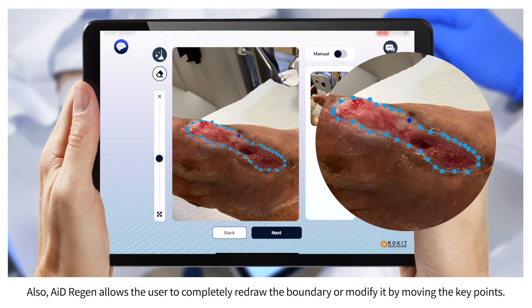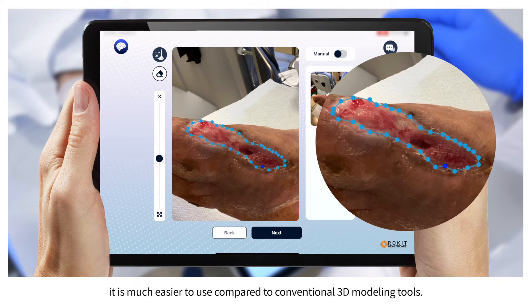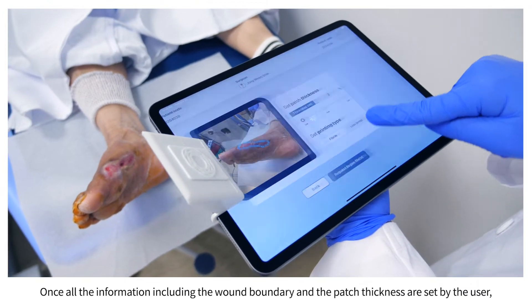AID Regen also allows the user to completely redraw the boundary or modify it by moving the key points. Since all the user interaction is done on the 2D image, it is much easier to use compared to conventional 3D modeling tools.